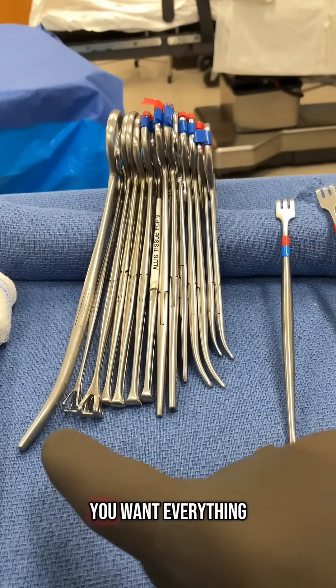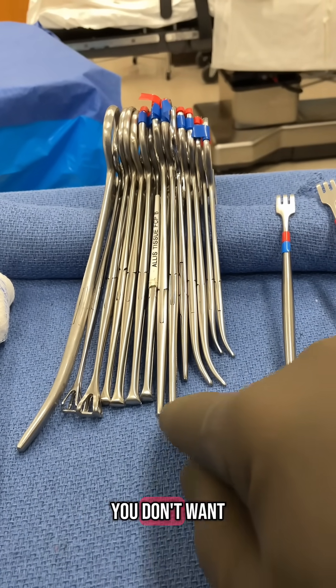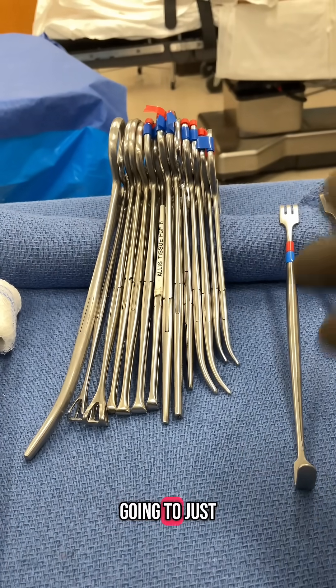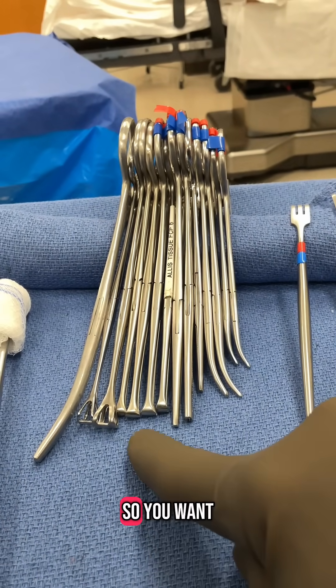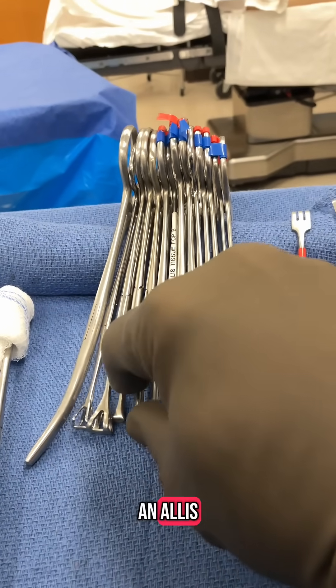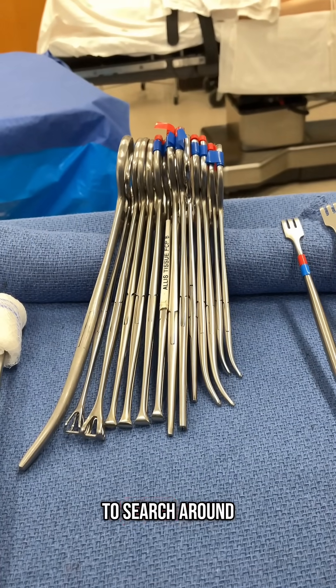When you're setting your mayo stand up, you want everything to be nicely organized. You don't want things overlapping because when you pick one up, you're going to throw a bunch of them everywhere. You want these to be where you can see them and know where they are. If you ask for an Alice, you can get an Alice — you don't have to search around for it.